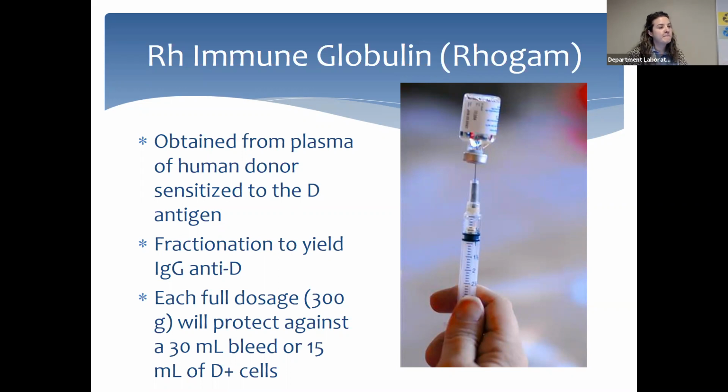So two questions. On that bleed, would we be able to see that with hemolysis? So there is a test that we do in blood bank. It is not quantitative, it is qualitative, and it is the fetal screen. And so you guys will actually get to do that. If your fetal screen is positive, and there's a disclaimer, fetal screens should only be performed on Rh negative females, okay? If she's Rh positive, even weak positive, then your result is going to be positive, all right? Because we are detecting the presence of Rh positive cells among the majority population of Rh negative cells, okay?